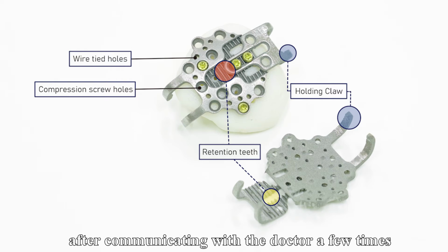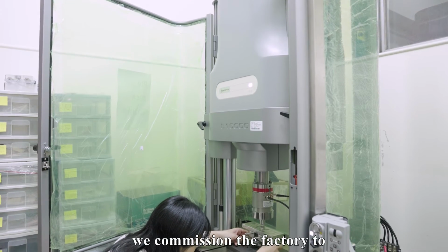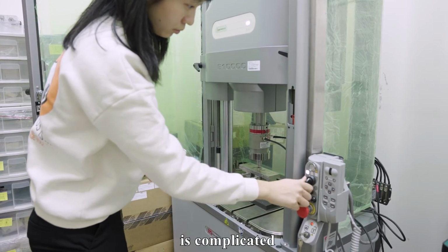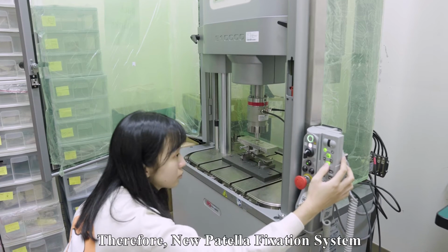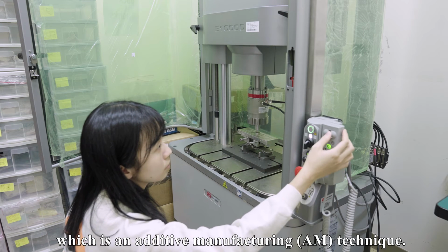Ultimately, after communicating with the doctor a few times, we have produced the final prototype, which is shown on the screen. After verifying the prototype, we commissioned the factory to manufacture the new medical implant. The structure of the new patella fixation system is complicated, and it's hard to manufacture by a general machining process. Therefore, the new patella fixation system is manufactured by DMLS, which is an additive manufacturing technique.